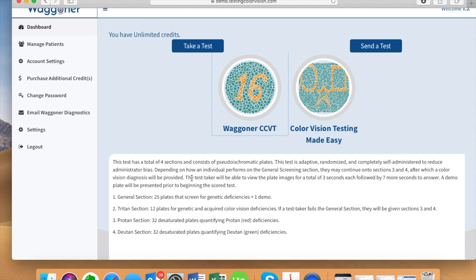From the dashboard you will see the ColorVision test that your organization has the option to take. For some of you, that may only be the Wagner Computerized ColorVision Test, known as the Wagner CCVT.